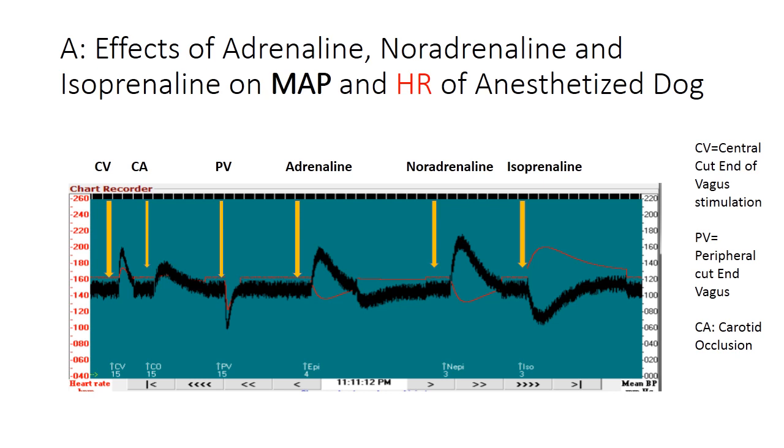Now adrenaline is injected after saline injection, and we see a clear cut biphasic response in mean arterial pressure. Initially there is a rise and then there is a fall, and in an appropriate setting this rise will be associated with a small notch, which I will show you in the next slide.